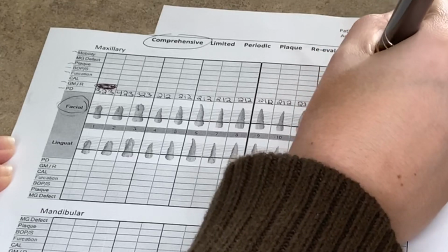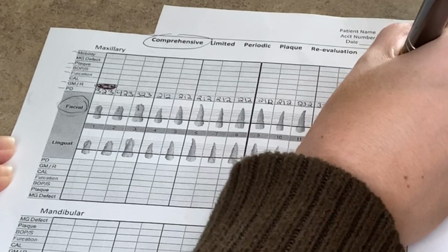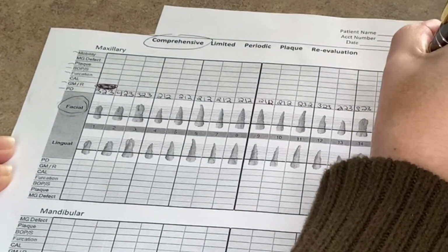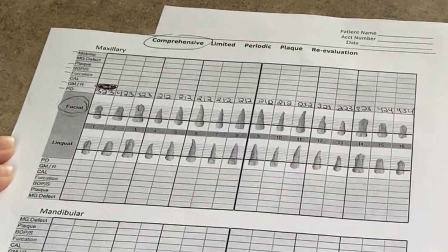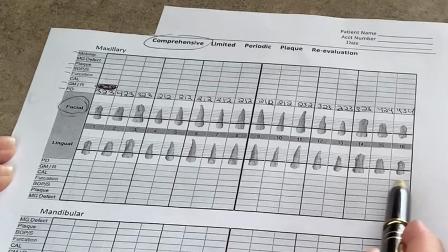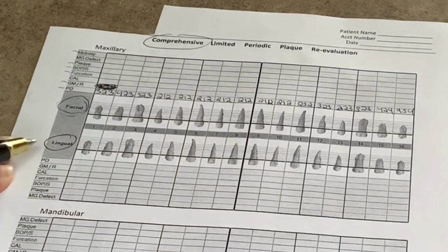And the 3 readings are the distal, the direct, and then the mesial on each tooth. So you'll go through and do all the facials. And of course you will skip any teeth that are missing or that the patient doesn't have.